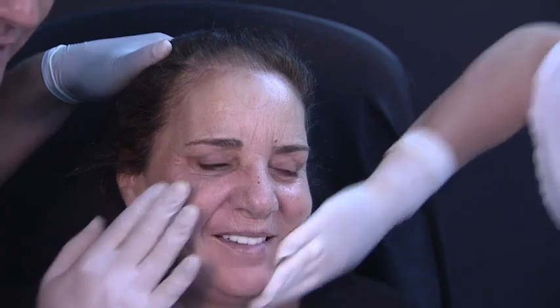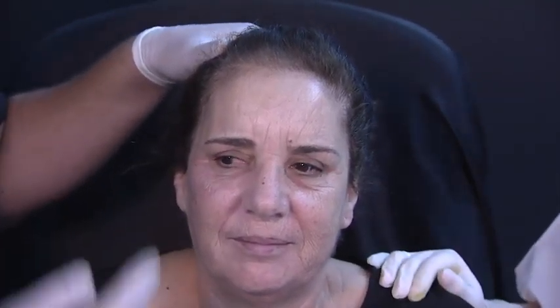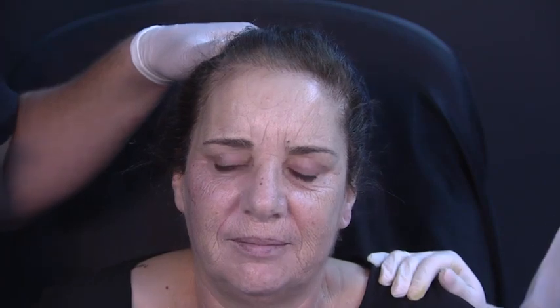Have her smile so we can see the fine lines as well. Can you smile? Smile. Okay, look at this. Okay, look at that. That's a nice improvement, although there is a little bit of lidocaine effect probably in the area also. So she might have a little bit more wrinkling later, but I think it's a very natural result. I mean, considering her severe photoaging.